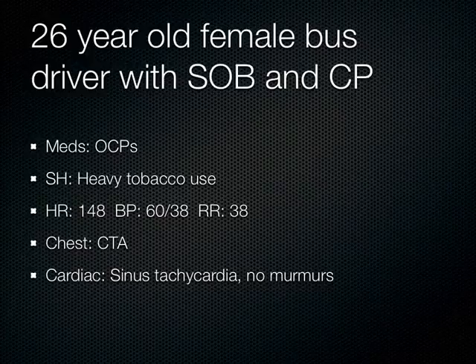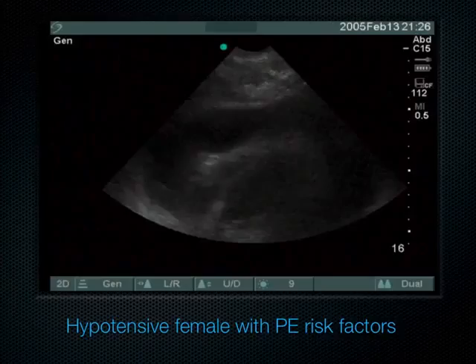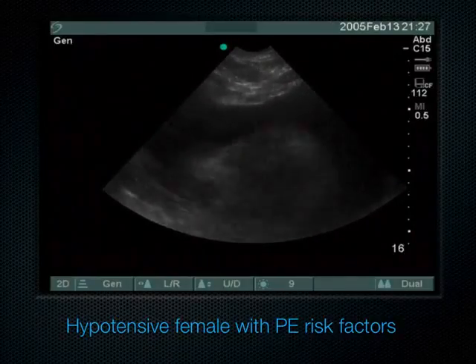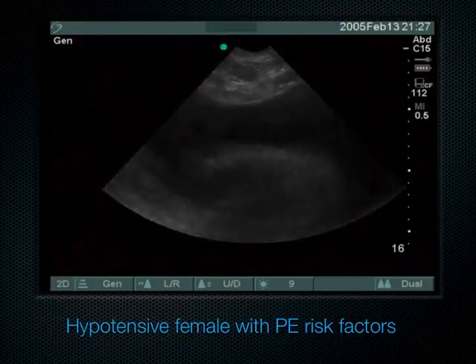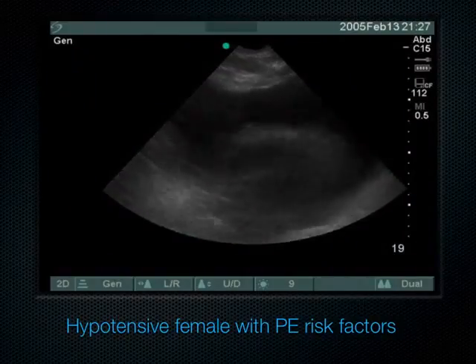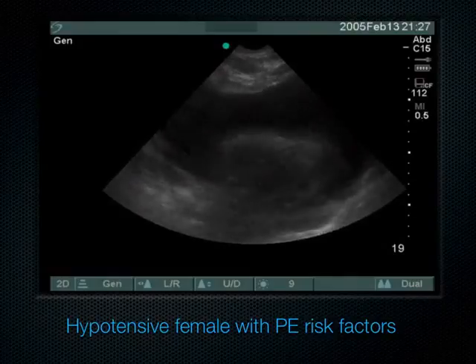How do you diagnose it? A CAT scan. But we can't put her in a CAT scan. He was like, well, is there anything else you can do? And then I was like, oh yeah, I can do an ultrasound. And so I brought the ultrasound machine over, and I did this. Excuse me, nurse, did you already push the thrombolytics? No? Good. Because that would have been the exact wrong thing to do, right?